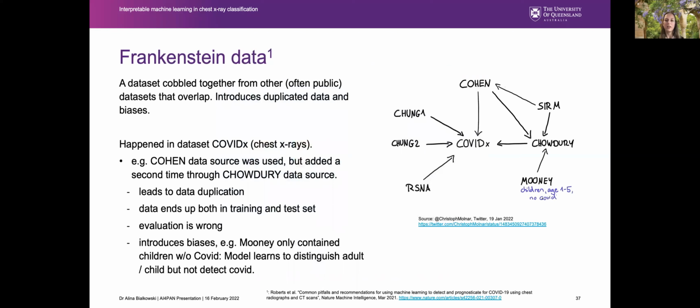Now, as I briefly mentioned just before, it turns out there are actually quite significant problems with the data set that this COVIDNet model was trained on. COVIDx was actually composed of various other data sets. We have these ones here, so that's all fine. However, once you go to here, we can see a couple of problems. One, this data set here for healthy normal patients was collected from children aged 1 to 5. So there's going to be a bias present in the data because in all of the other classes, for example COVID, it'll never be a young patient.